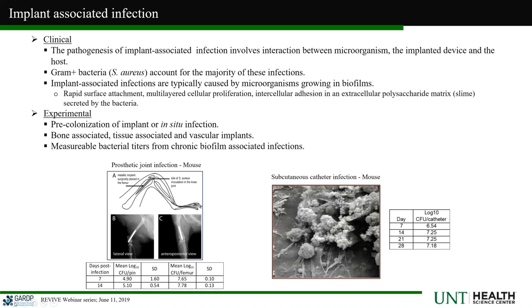Subcutaneous implant. This is a Teflon catheter that's implanted subcutaneously. We went back and looked at scanning electron micrographs of that to prove we had a biofilm infection. And this is stable over a very long period, about 28 days with 7 logs of bacteria present on that implant. So prosthetic joint or any type of implant-associated infection is an extremely serious, hard to treat, very chronic infection. A lot of times the clinical cure is removal of the device. So an animal model that can mimic the longevity of that infection becomes important.